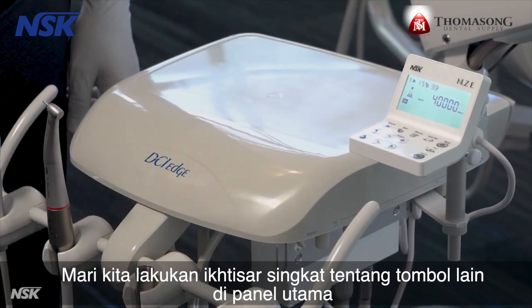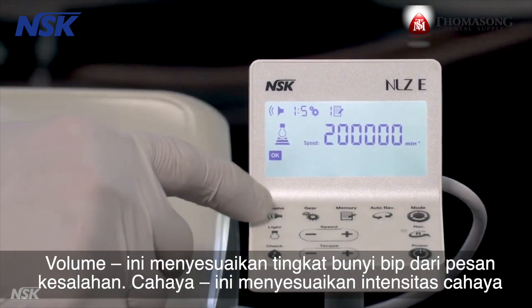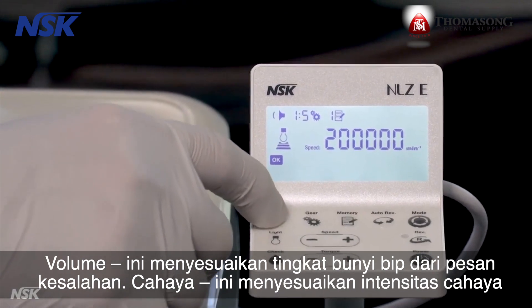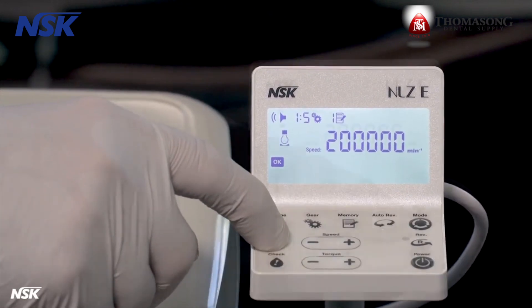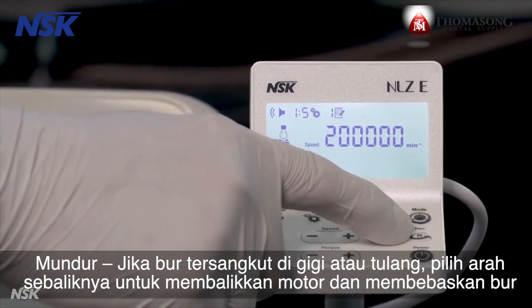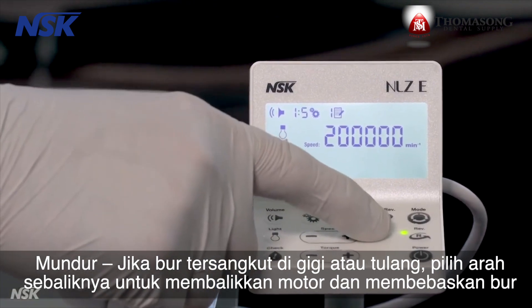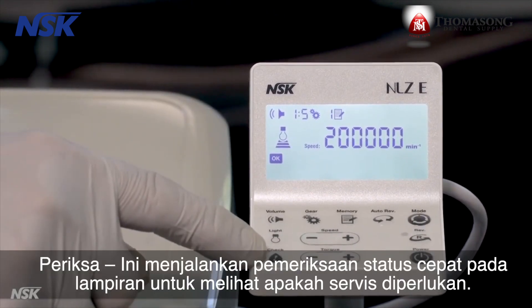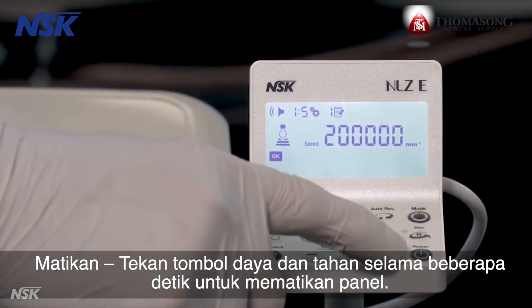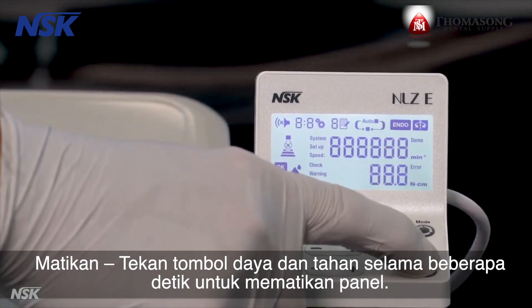Let's do a quick overview of the other buttons on the touch panel. Volume adjusts the level of beep sounds of the error messages. Light adjusts the intensity of the light. Reverse: in the unlikely event a burr is stuck in the tooth or bone, choose reverse direction to reverse the motor and free the burr. Check runs a quick status check on the attachment to see if service is necessary. Power off: press and hold the power button for a few seconds to turn off the touch panel.